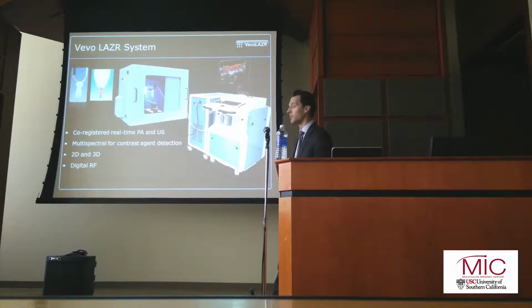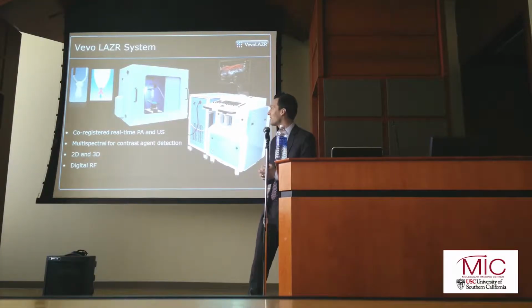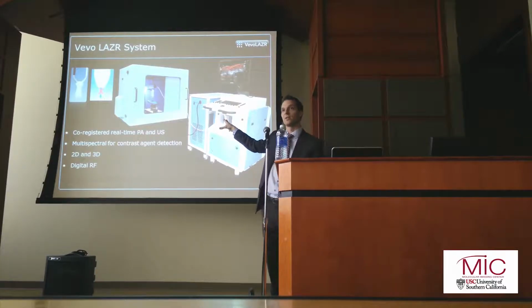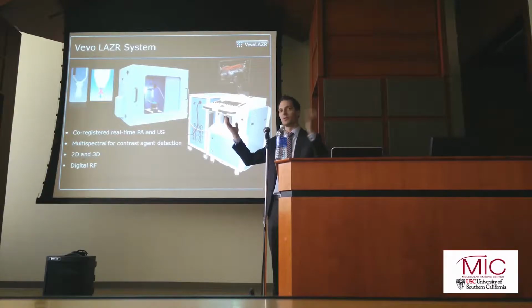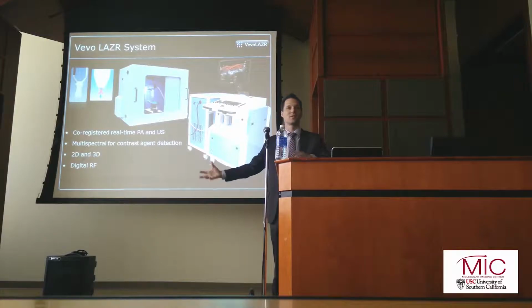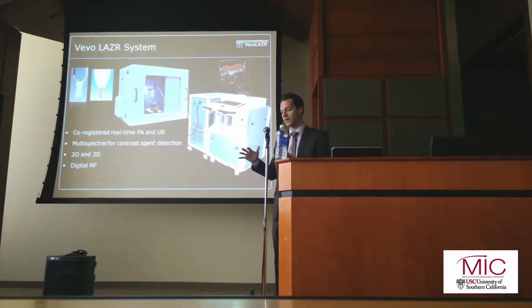This is what the system looks like if you haven't seen it yet. And if you haven't, please speak to Li Peng and she can give you a tour down in the MIC facility. This is the ultrasound system on the right. That's the guts of the system. Right beside that is the laser. If anyone's been to a laser lab, you go in, the windows are blacked out, you've got a table that's floating on air, optics everywhere, a heating or cooling system, power supply, all these things. You've got to wear safety glasses, have a laser safety officer. We've taken all of those things and put them into this one cabinet.